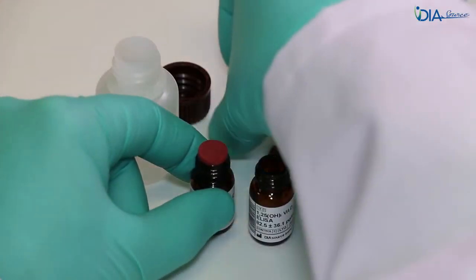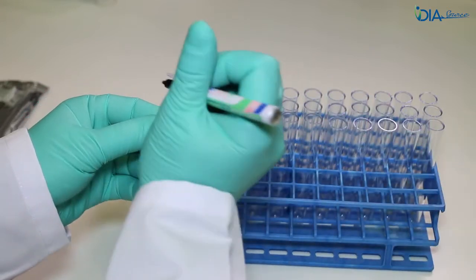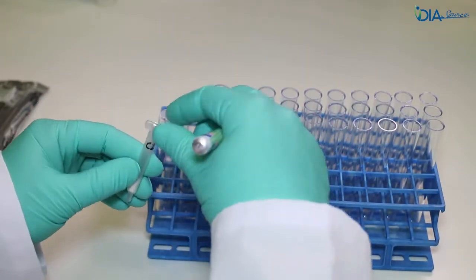During this period, prepare and label the glass tubes for the extraction, for the separation wastes, for the water, for the elution, and prepare and label the silica cartridges.